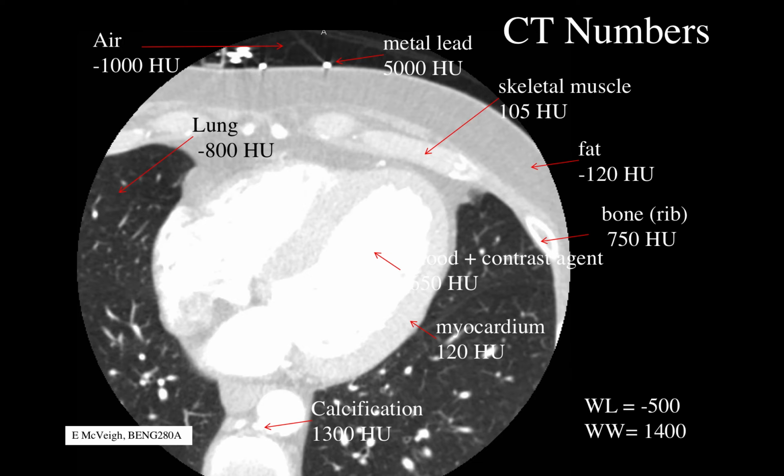So you'll get 1,300 Hounsfield units, and inside the lumen of the artery you have 300, and the lack of spatial resolution broadens out this big signal and interferes with the stuff you're trying to see. So that's called calcium blooming. It's essentially just lack of resolution.